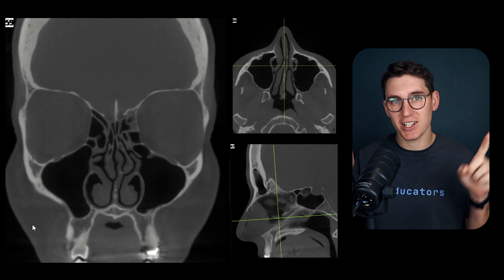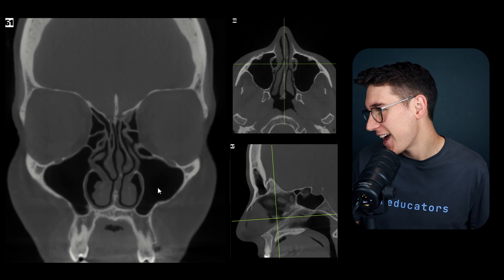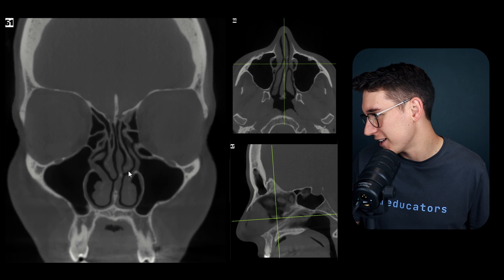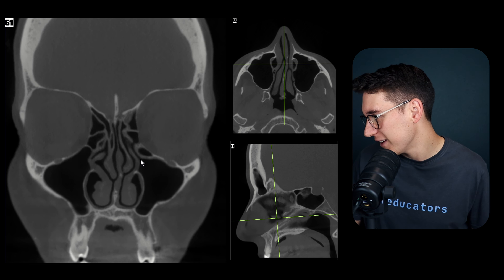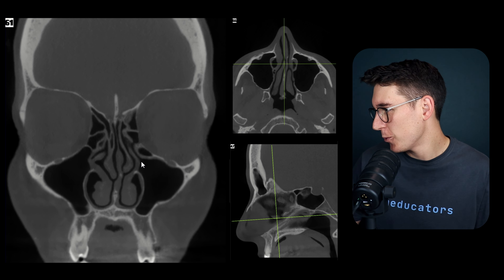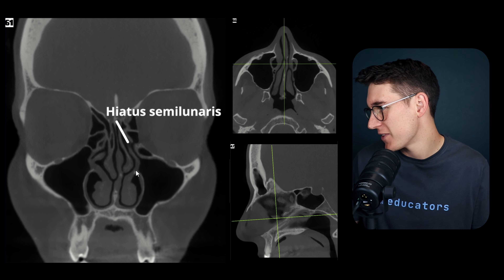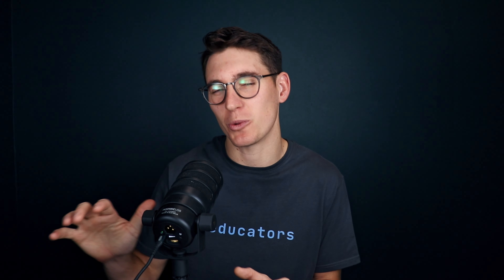Different structures drain into each meatus. The maxillary sinus drains into the middle nasal meatus through a complex known as the osteomeatal complex. This opening is called the maxillary ostium, and drainage extends through the infundibulum into a structure known as the hiatus semilunaris. This hook of tissue is the uncinate process - uncinate meaning hook-shaped, as we've also seen in the pancreas.